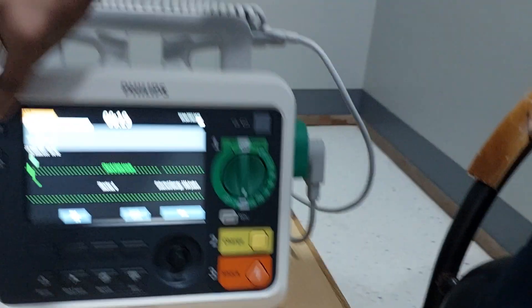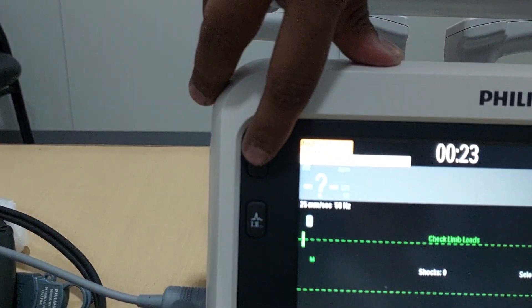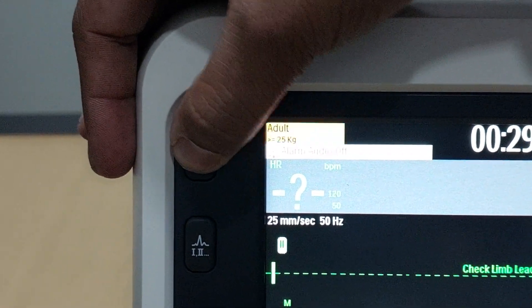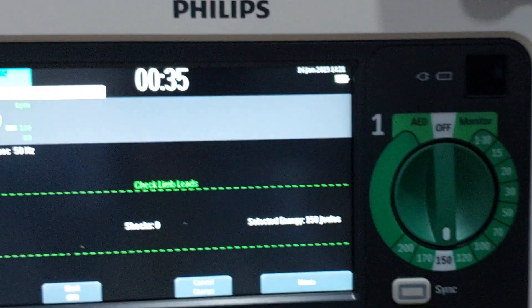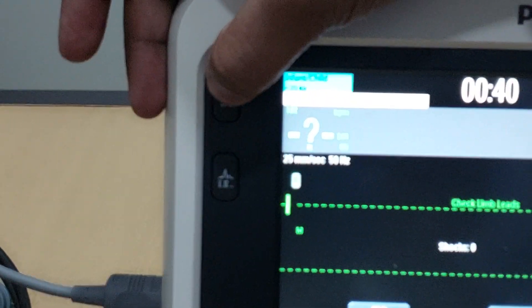One more thing I have to tell you: this is the adult/pediatric selection switch. The machine has adult as well as pediatric mode. If you switch it, it will come to infant and child mode. When on infant and child mode, the machine will not deliver a shock more than 50 joules — that is the limitation. So when treating an adult patient, you have to make sure to select adult mode.